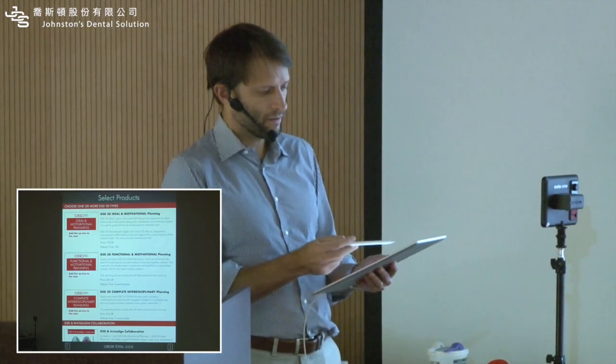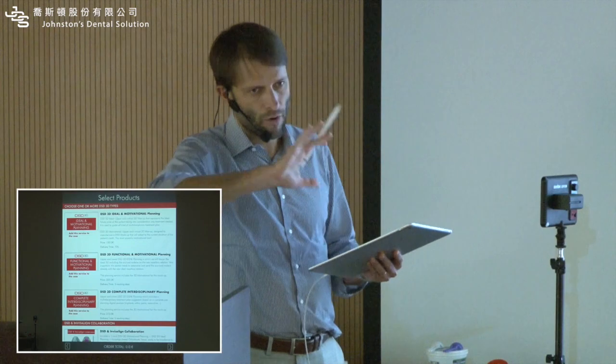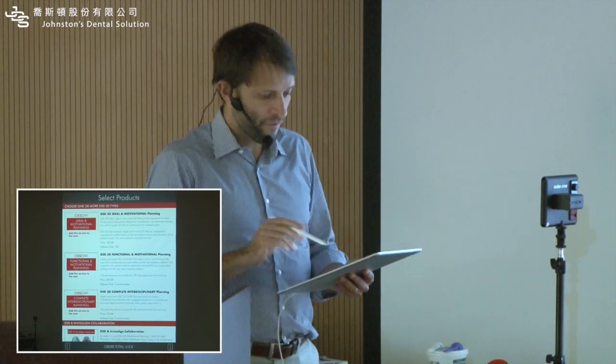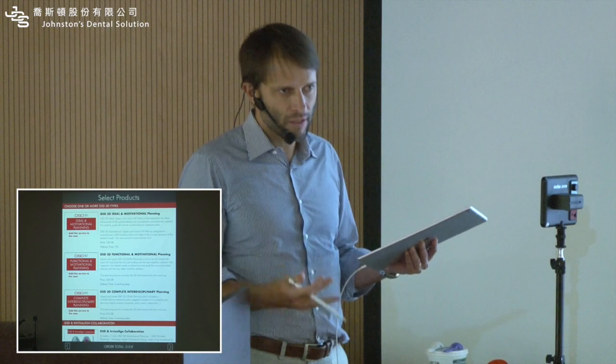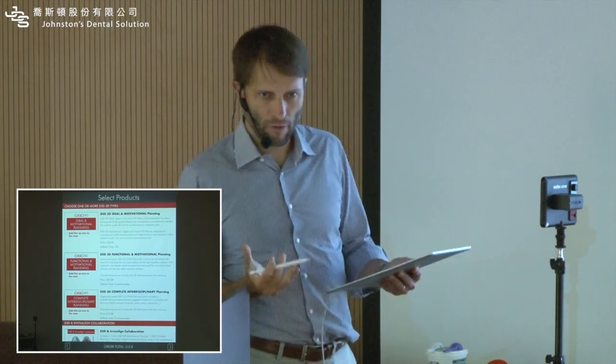Quick explanation. DSD 3D is the entrance, is the most common, is what I suggest you to try first. Functional is the same, but with upper and lower wax up. So if you know that you're going to need also the design of the lowers, you can go straight to the second one, upper and lower.